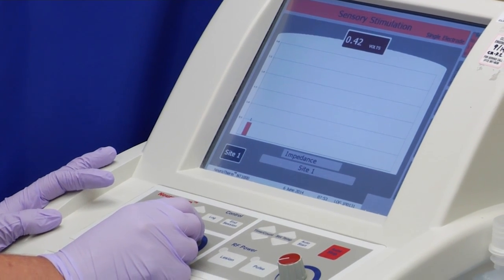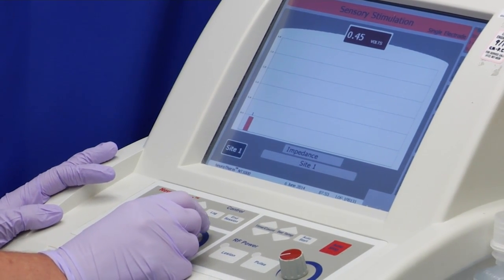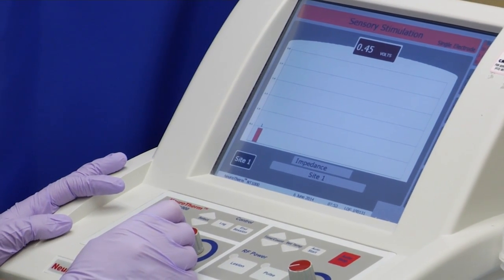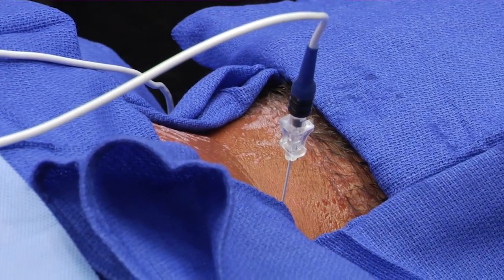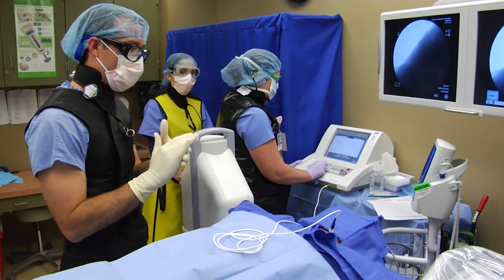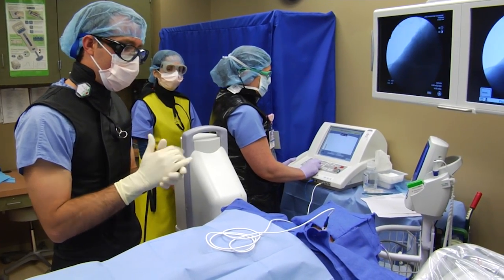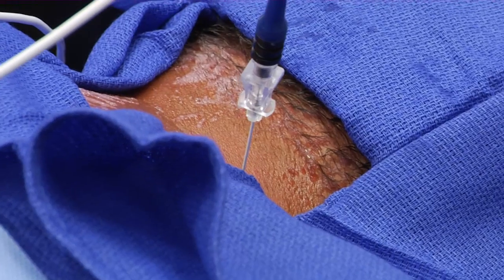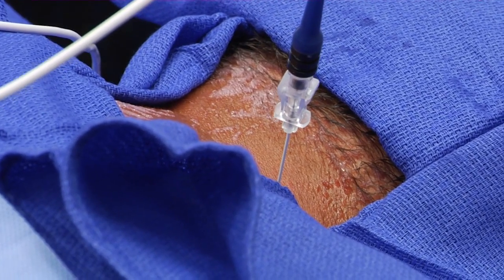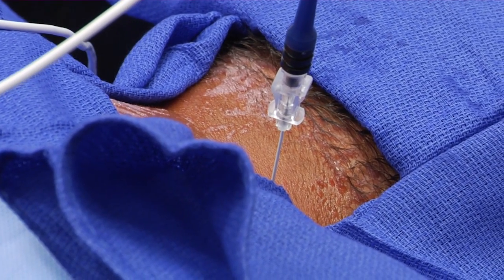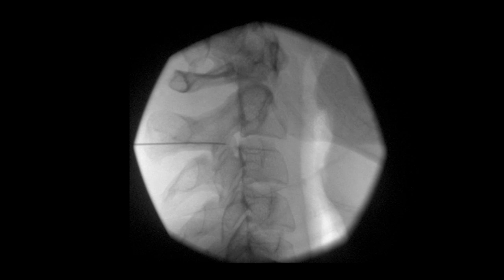At that point, my assistant switches to 2 Hz motor stimulation and slowly increases the stimulation to 1.5 V, typically at least 3 times the sensory threshold. As we can see, the multifidi are contracting, but there is no stimulation in the upper limb muscles. On the lateral view, the needle tip remains in the same position posterior to the neuroforamen.